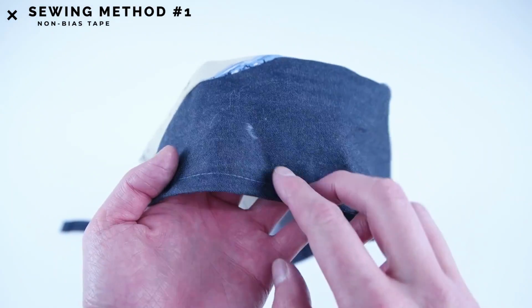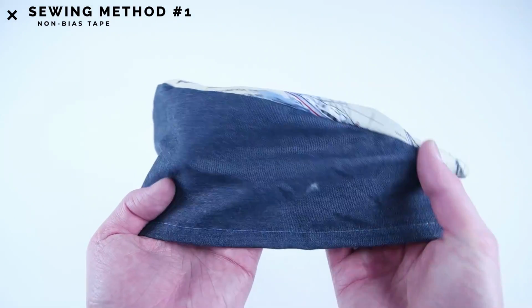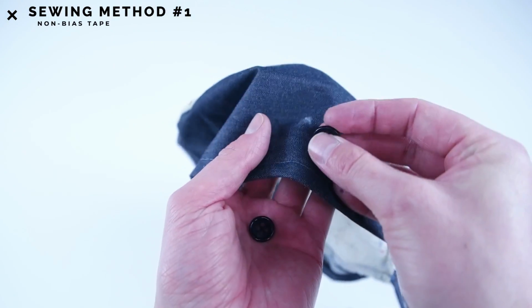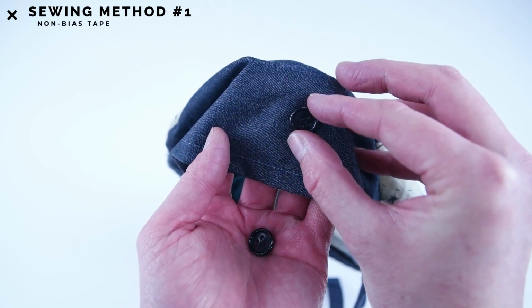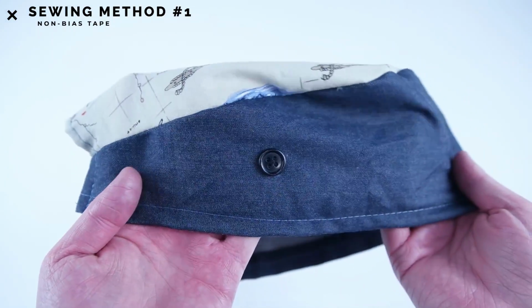And the last step is adding the buttons, and this is going to be different for everyone. I recommend putting the cap on and feeling where your ears are and then making your marks. Once you have your marks made, you can hand sew your buttons on. And that completes the first method of making this scrub cap.